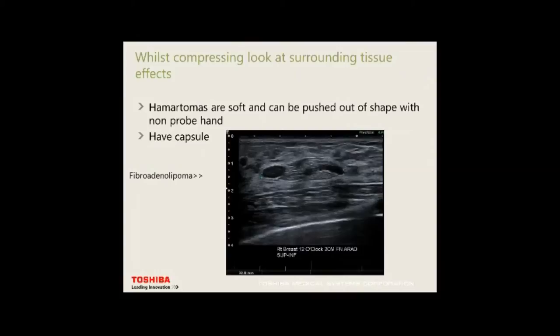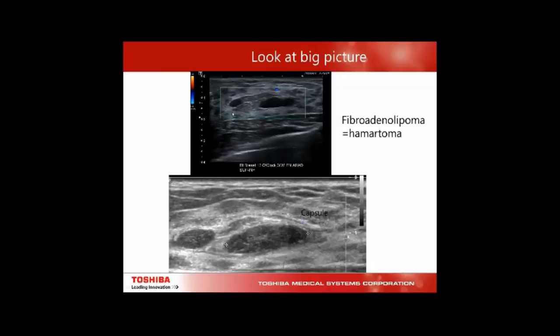While compressing, look at surrounding tissue effects. Hamartomas are soft and can be pushed out of shape with the non-probe hand — they also have a capsule. Hamartomas are fibroadenolipomas: made of normal breast tissue in an abnormal form. This particular hamartoma had previously been described as two fibroadenomas. Always look at the big picture and look for the capsule — we can see the capsule coming all the way around here.